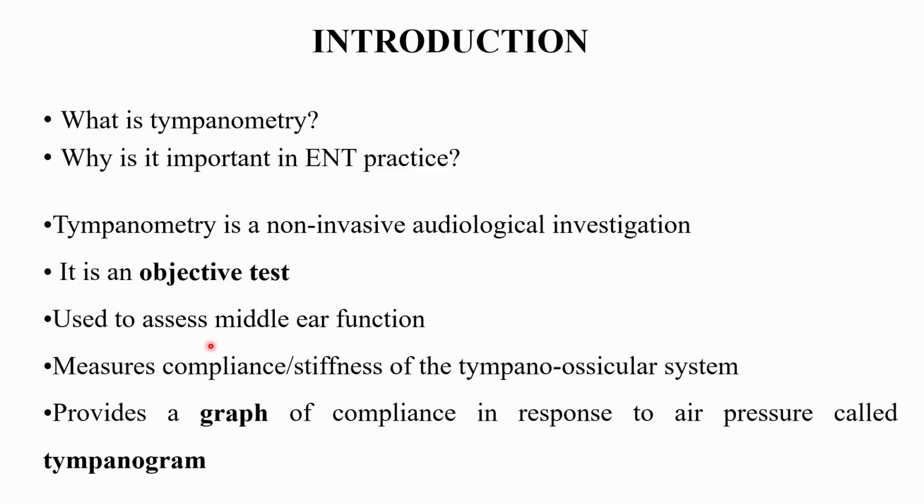It is used to assess the middle ear functions. It measures the compliance, which is the movement of the eardrum, and stiffness. If the eardrum is thick or does not move much, it means it is stiff.